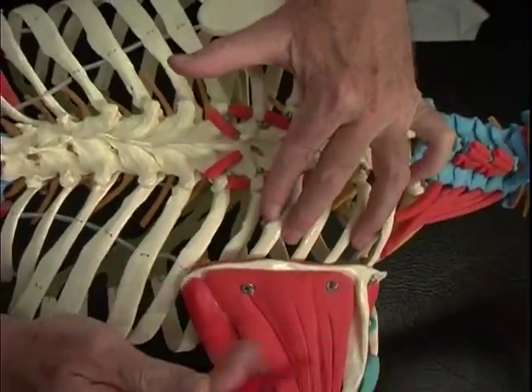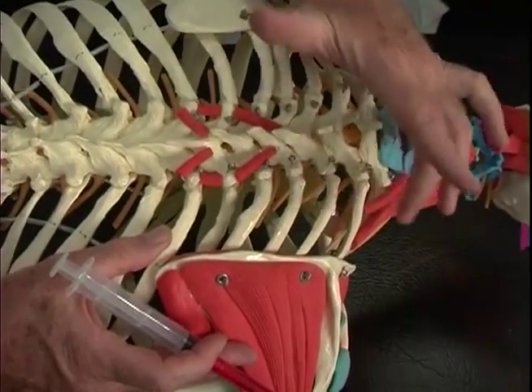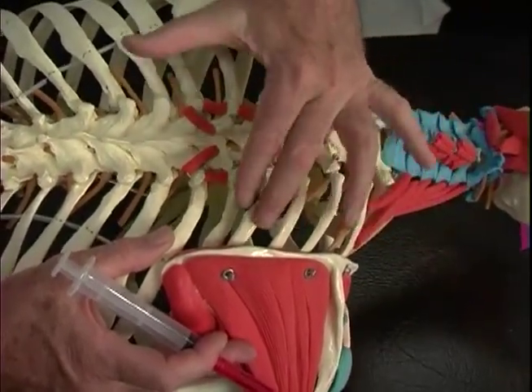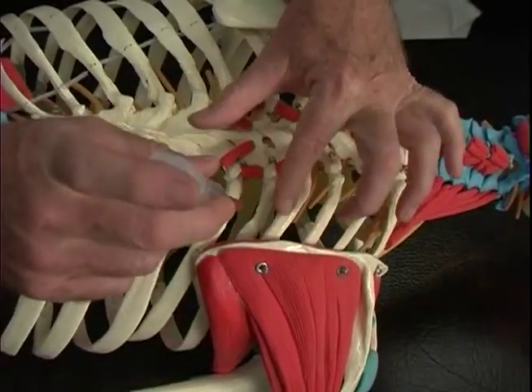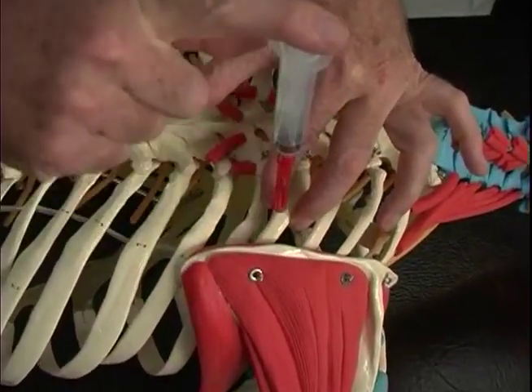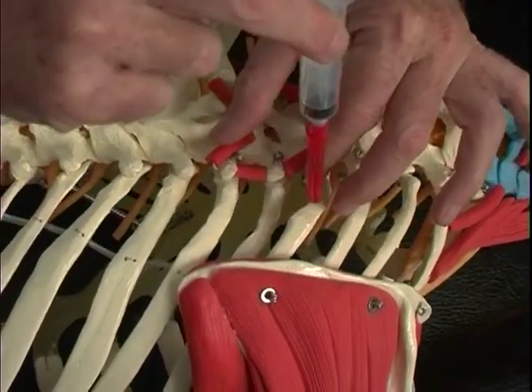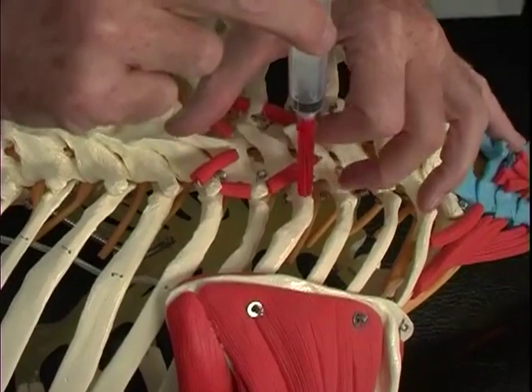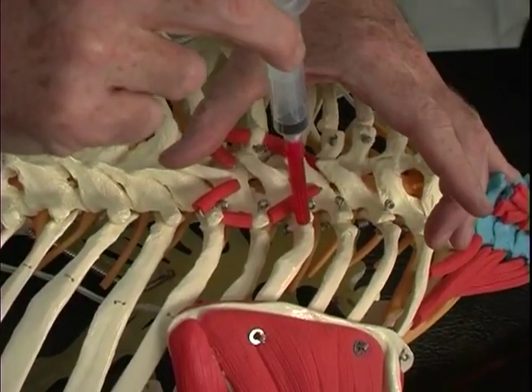We lock our fingers directly on the rib, picking a rib down here. There's 3, 4, 5, and 6. And so picking the 6th rib where we can feel that bump, coming directly into the bump of the rib, perpendicularly right down on it. And then we can walk our needle across the rib till we get to that rib transverse process junction.